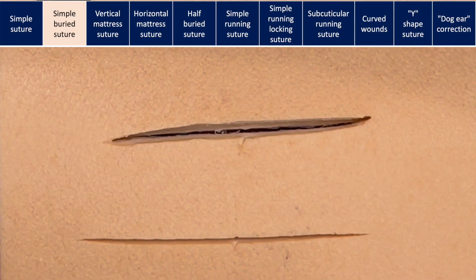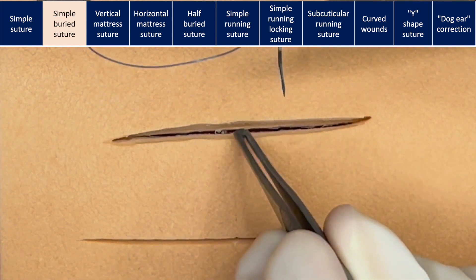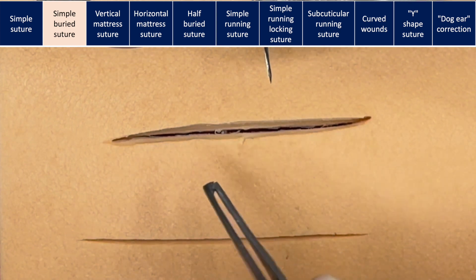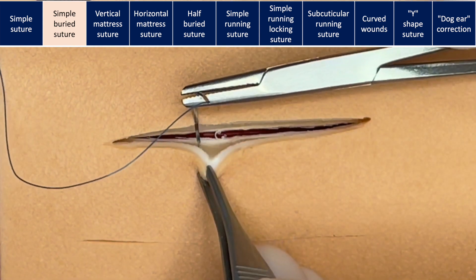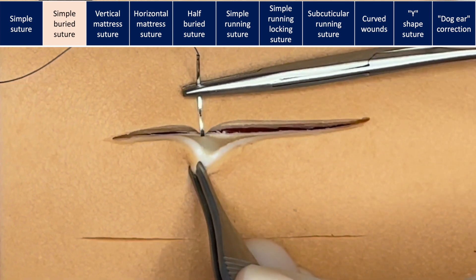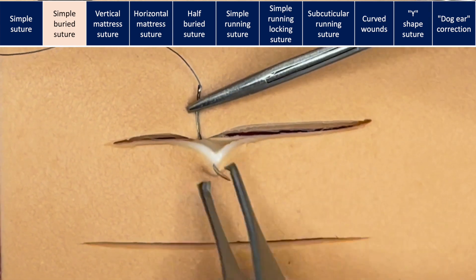Simple buried suture is the suture that we will use for placing deeper sutures to re-approximate the skin before putting the skin suture in, usually with absorbable suture. We start deep and then go superficial and up in the dermis, taking care not to pierce the skin.